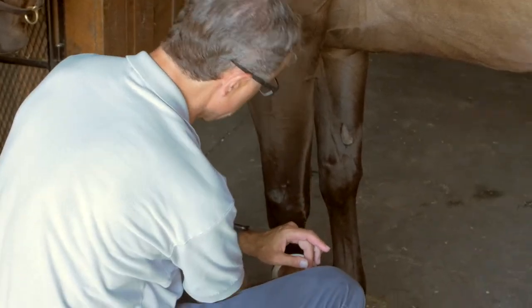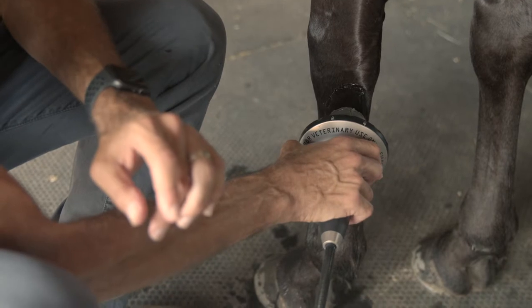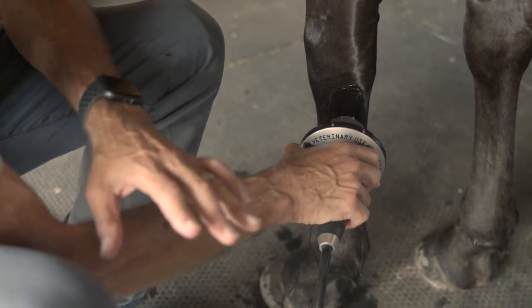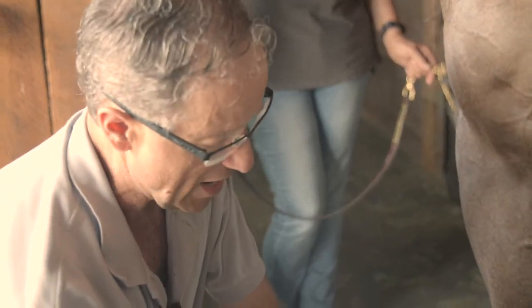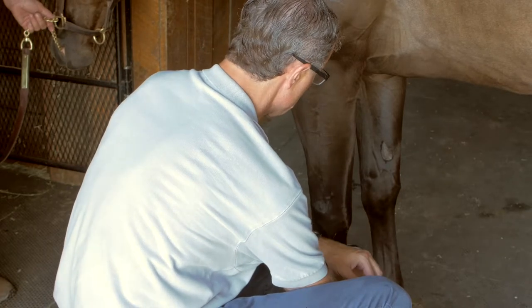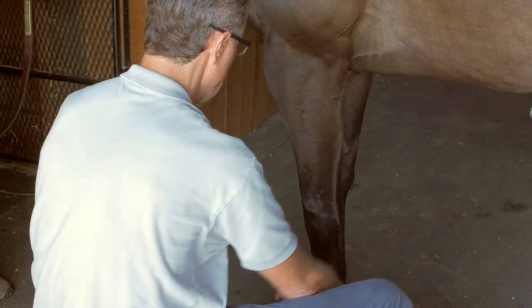If you listen carefully, you can hear when I've lost contact. Because of the contour of the leg, you have to press a little bit — start up high again and go down, making sure you have contact. I'm putting a little more pressure on as I get into this area, but remember: with ultrasound gel, if you push too hard, you push the gel out from between the offset pad and the horse, just like when you're scanning for diagnosis and lose that beautiful contact.